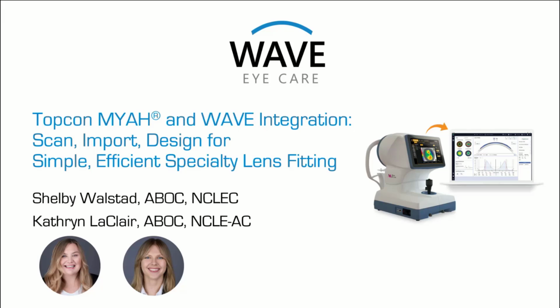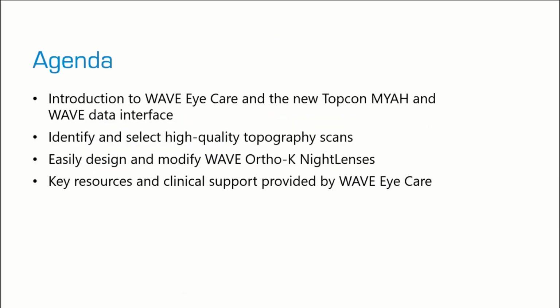Welcome to the webcast, TopCon MYAH and Wave Integration, where we'll scan, import, and design for simple, efficient specialty lens fitting. In this webcast, we'll give you an introduction to Wave Eye Care and the new TopCon MYAH and Wave Data interface. We'll show you how to identify and select high-quality topography scans and use those to easily design and modify Wave Ortho K-Night lenses. We'll also share with you key resources and clinical support that is provided by Wave Eye Care.